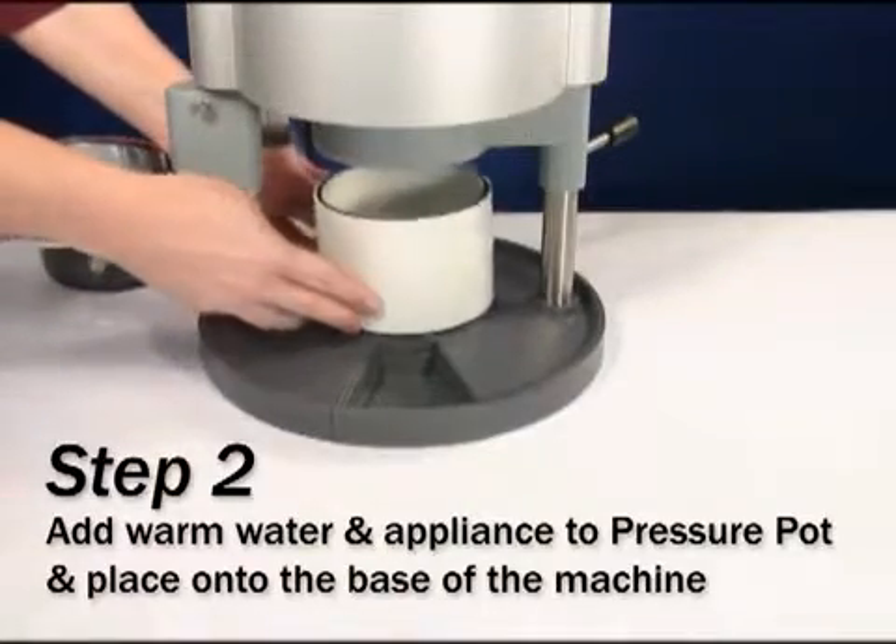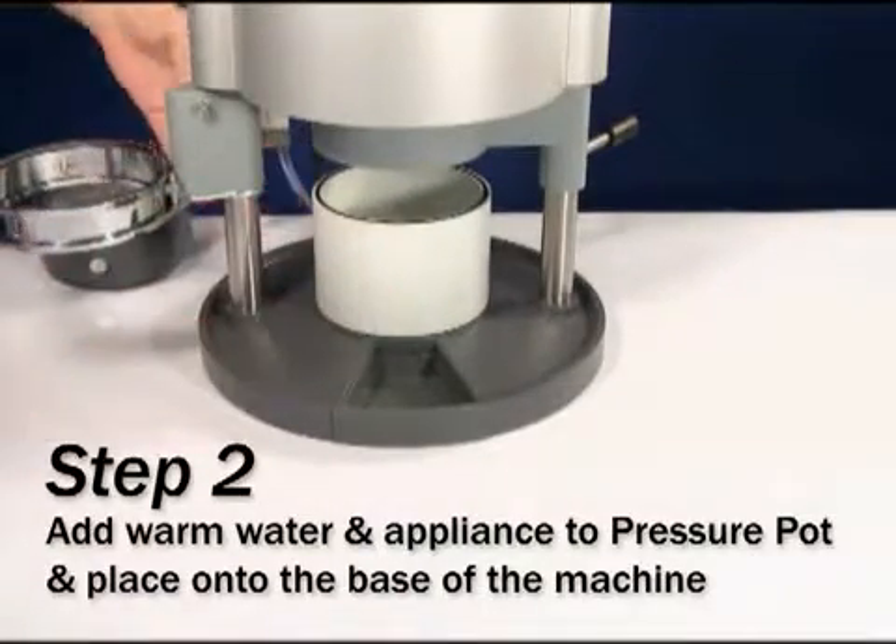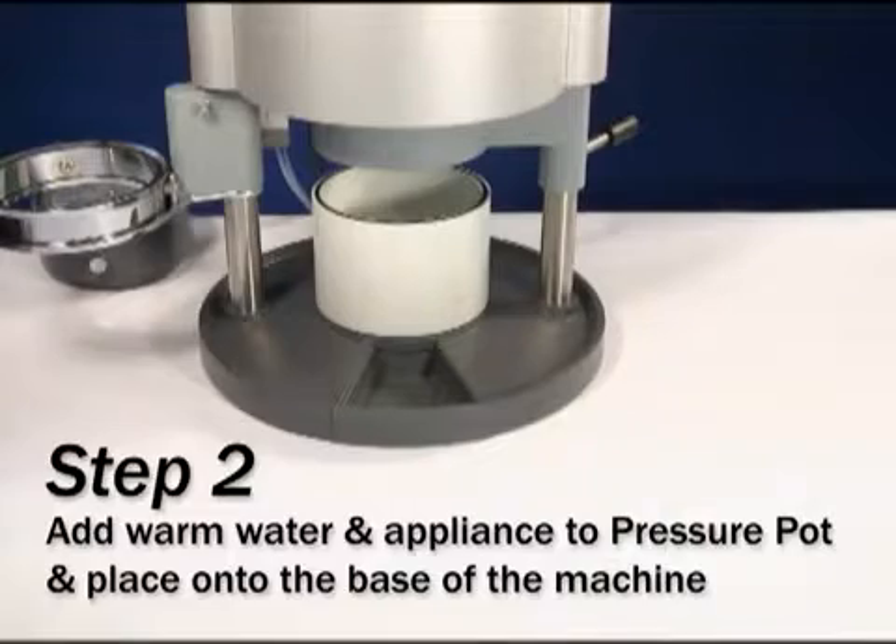Add enough warm water to the pressure pot to cover the appliance. It should be more than halfway full. Place the filled pressure pot onto the base of the drufomat scan.